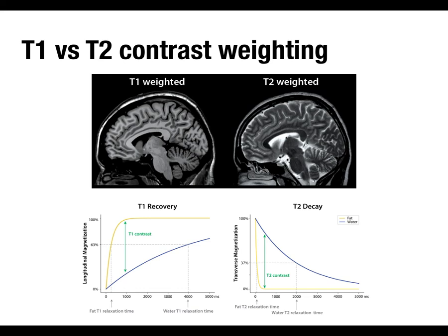And so you might see that, but there's actually a few reasons why you might see dark spots in white matter, including just blood vessels going through there, because blood is more watery, and so those can cause little black spots, which caused me a lot of concern the first time I saw a structural image of my own brain. It was fine. But if you also have a T2 weighted image, then that'll help because you've got different weightings, and now the white matter holes or the plaques should appear brighter in that one.